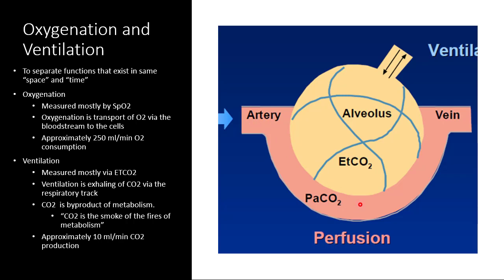You also eventually reach a point where your PaCO2 and the CO2 in the alveoli become equal and there's very little gas exchange. But also keep in mind that if there's no gas exchange, your CO2 will build up, this will become higher. It will then diffuse across, the point of equilibrium will go higher, and you'll get large amounts of CO2 build up in the alveoli until eventually the patient dies or you start washing it out. So I hope that makes sense.